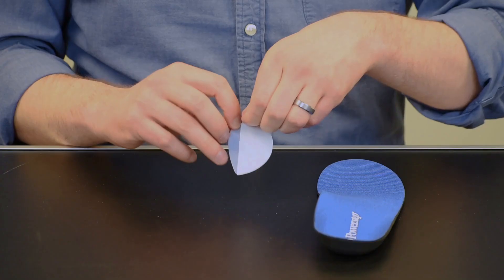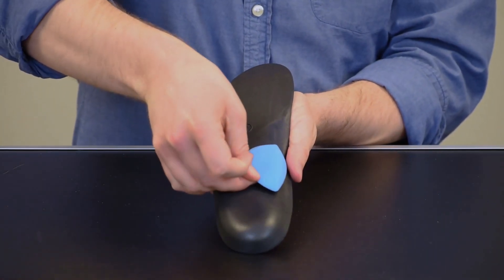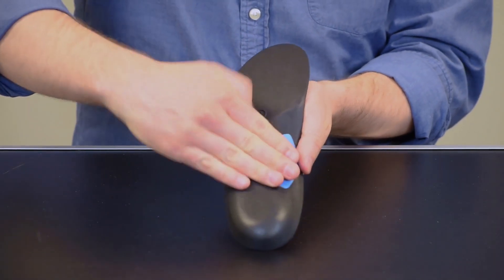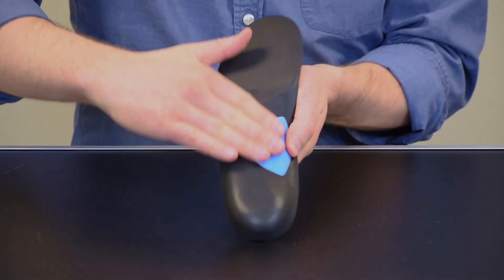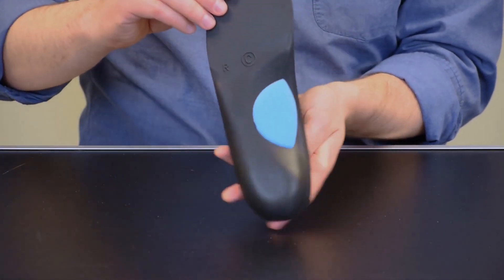To apply, remove the adhesive backing from the cushion and attach to the bottom of the orthotic directly under the arch with the adhesive side against the orthotic. The semi-circular side should face toward the center of the orthotic. Adjust the position as necessary for comfort.